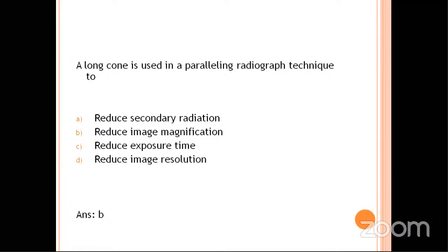Okay. So why we use the paralleling radiograph technique is that it is the one where we can actually repeat or take the radiograph again and again to see some prognosis. So if a patient is treated for a bone loss, and they ask what is the best technique to see the review, whether it is bisecting or paralleling technique, it is actually paralleling technique.